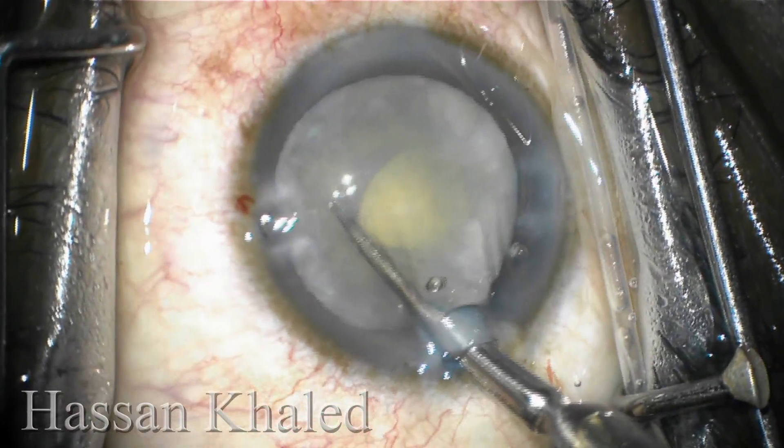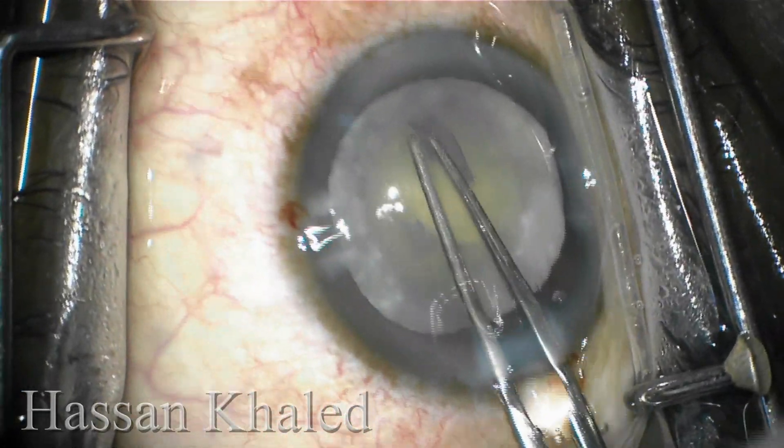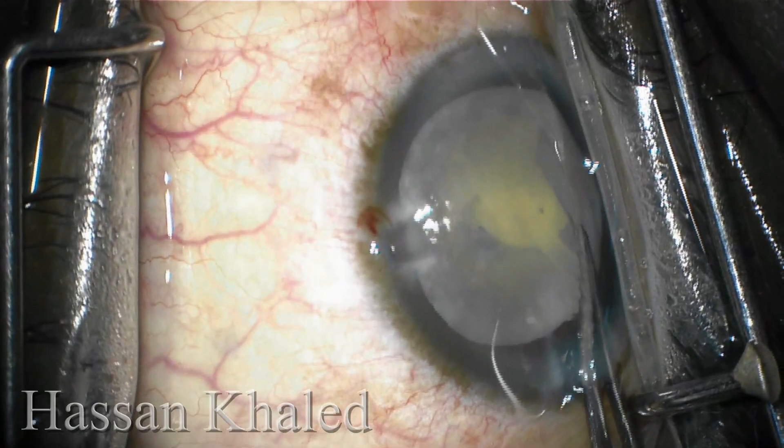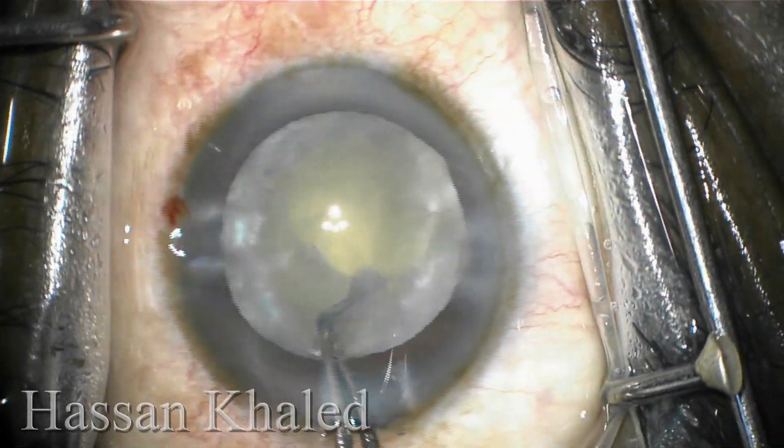Then using the micro scissor to do a small snip in the anterior capsule to enlarge the capsulorhexis. The second capsulorhexis is supposed to be 5 or 5.5 millimeters in diameter.